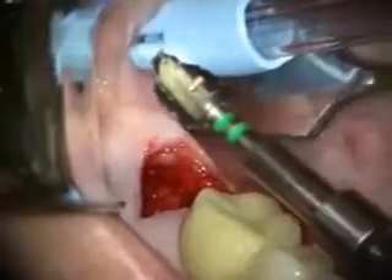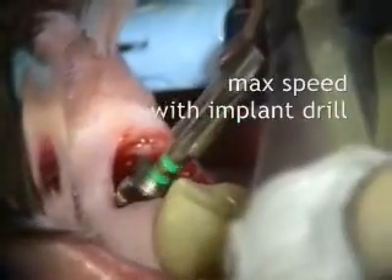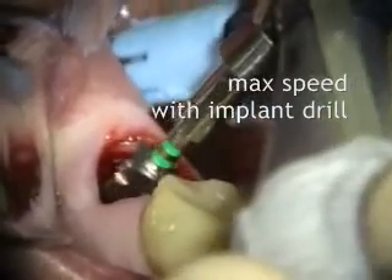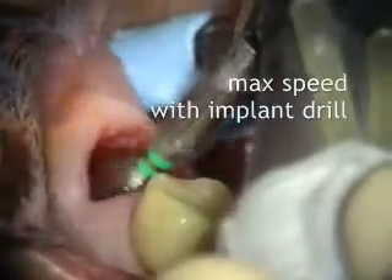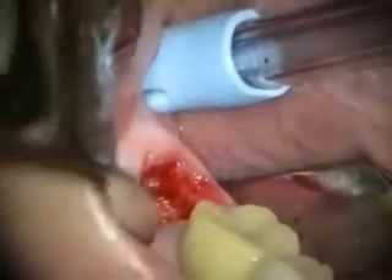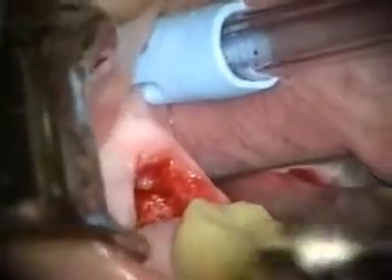We're putting this drill on an extender — you're going to feel a lot of vibration now. A lot of water, a lot of vibration.